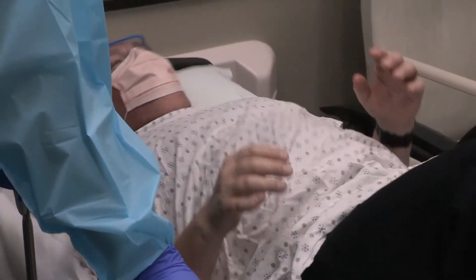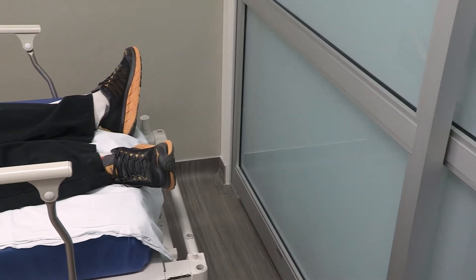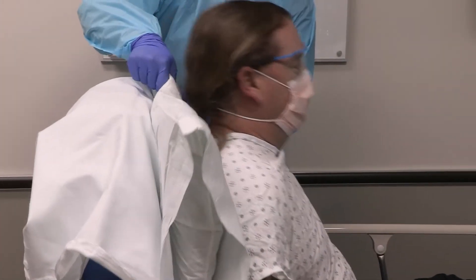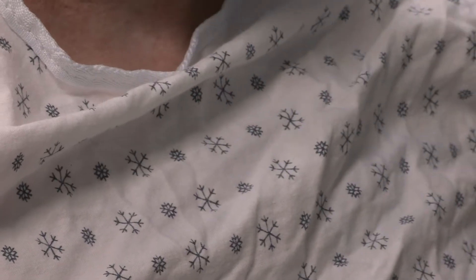The nurse will position the patient on the bed with their head at the top of the bed and their back flat against the bed. The nurse will move the bed close to the glass window; the end of the bed should be perpendicular to the glass. Next, the nurse will lift the head of the bed to 90 degrees and remove the pillow from behind the patient. If present, necklaces and bra should be removed, as well as EKG wires if appropriate.